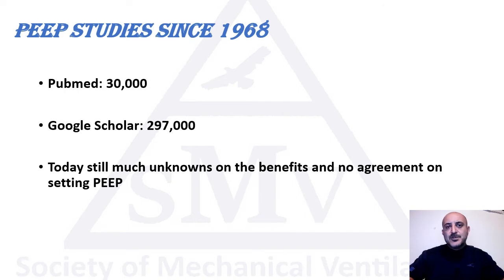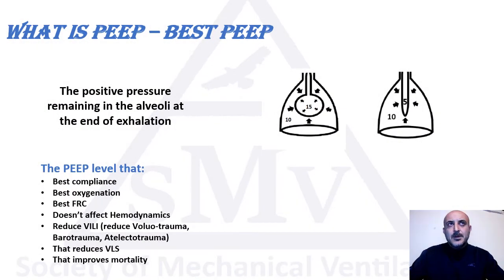Perhaps PEEP is the most studied aspect of mechanical ventilation since its inception back in 1968. If you search PubMed, you'll find more than 30,000 articles about PEEP, and on Google Scholar almost 300,000 articles. And after almost 50 years of research, there's still so much unknown about the benefits of PEEP and not much agreement on how we set PEEP. So what is PEEP and what is the best PEEP?